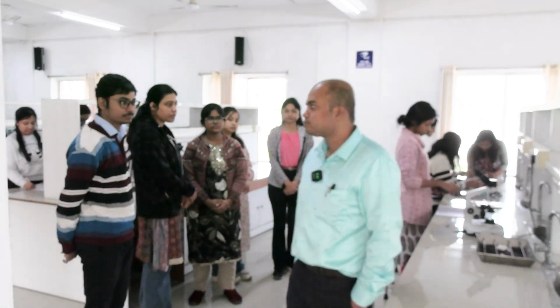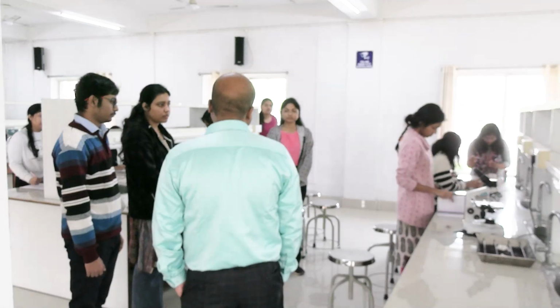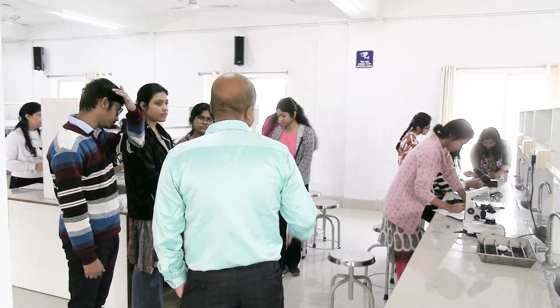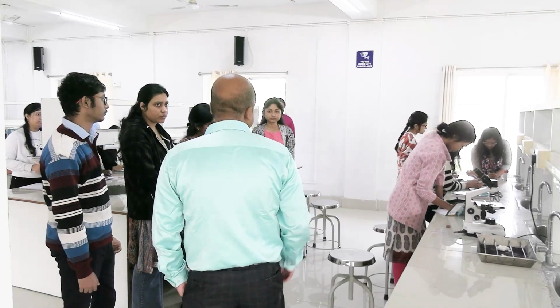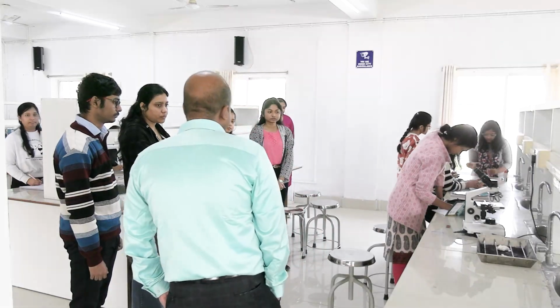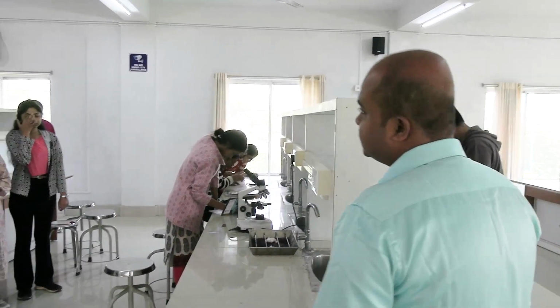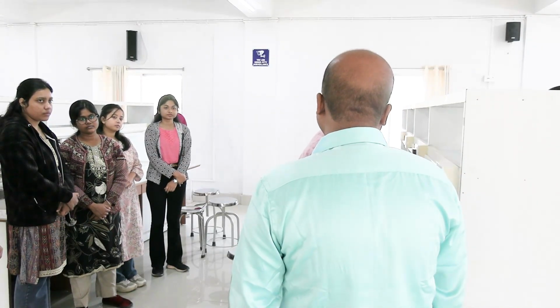followed by preparation and staining of a peripheral blood smear. That was the second topic. Second topic means topic is same, DLC. If you see your syllabus, topic is DLC, but to arrive to do this experiment, we must learn to stain. So first class was on study of the compound microscope, which we mention in the practical notebook. Then preparation and staining of a peripheral blood smear. Just listen. Then it will be identification of blood cells or identification of components of blood under the microscope. This is the third one.